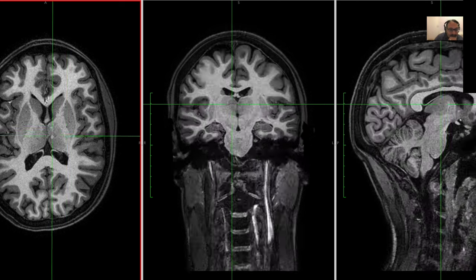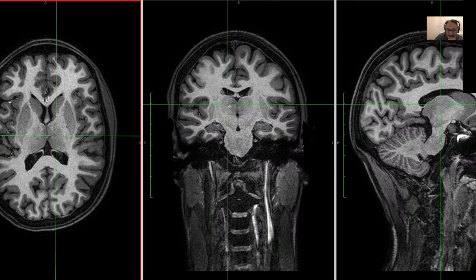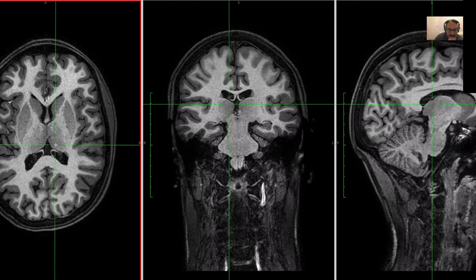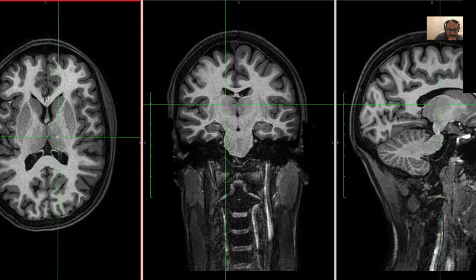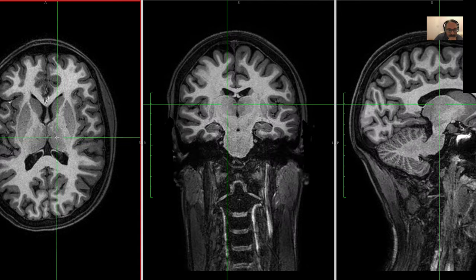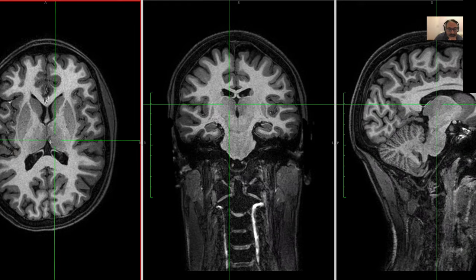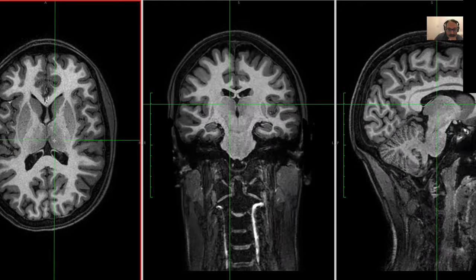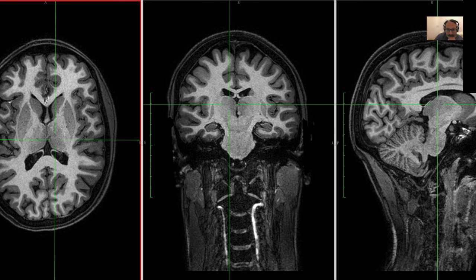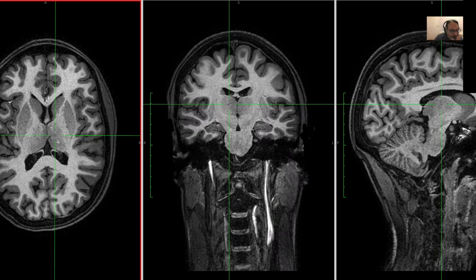This is the thalamus. I'm going to circle around the thalamus, and so you can sort of see it here. While I circle around the thalamus here, have a look where that is over there. And also have a look at where the thalamus is over there. So the thalamus is in between. Actually, the thalamus is not in between, but the third ventricle is in between the thalami. So that's your third ventricle there, and the thalami are on the two sides. And so that's basically an important thing to show you there.